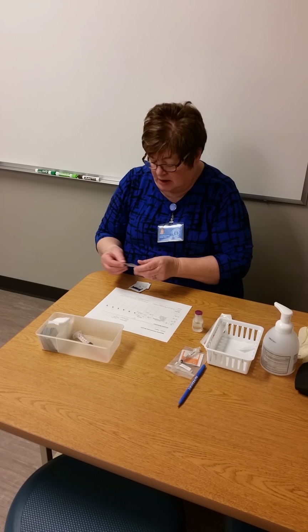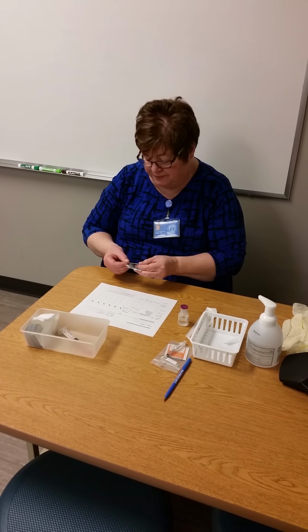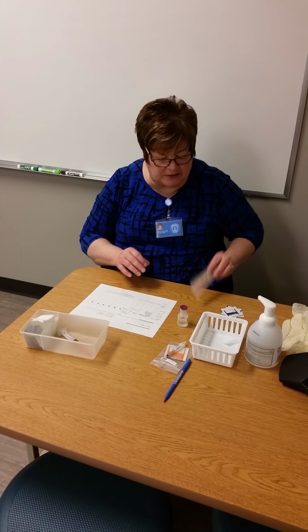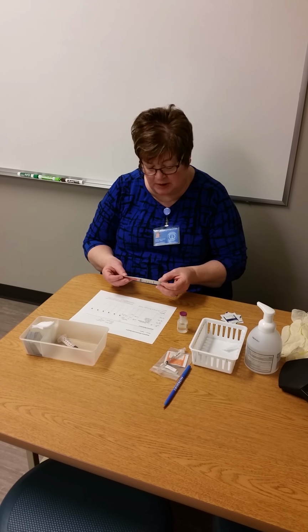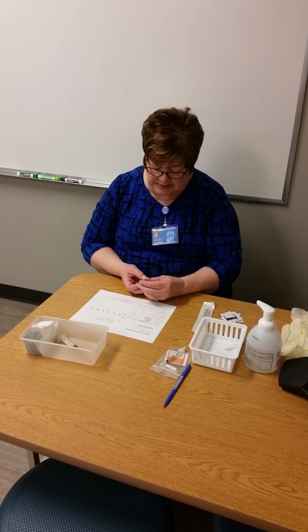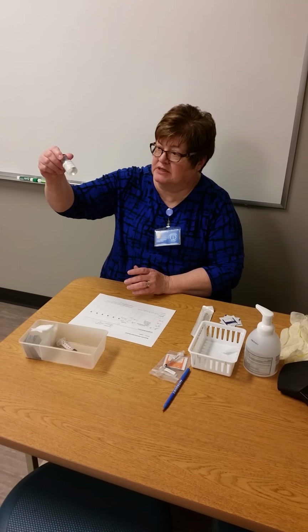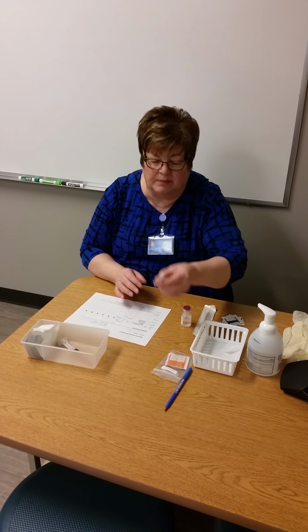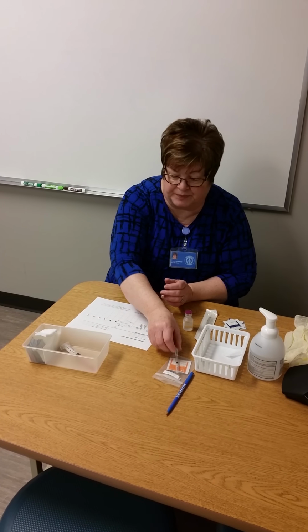Okay. Alcohol pledgets are intact. There's no expiration date on them. My syringe is intact. There is no expiration date on it. It's a 3 ml blunt fill needle. My sterile water is intact. 2017 is the expiration date. It is clear. Nothing is floating inside of it. And I have 1.5 mls available. My Tubersol, expiration date is 12/2018, and it is the appropriate color for the medication.